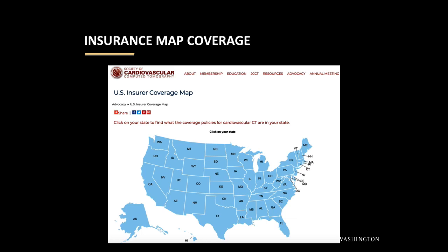But not just that, if the CTA showed negative or normal coronary arteries, a lot of those patients stopped taking medical therapy, and the patients that had disease were put on medical therapy. So it was kind of redirecting medical therapy targeted at patients with coronary artery disease. I really think it was just the fact that the CTA was more sensitive in picking up the disease, and that's why those patients got put on medical therapy.